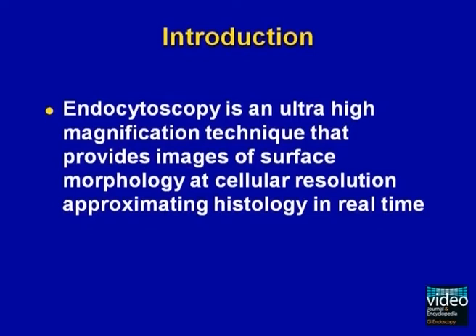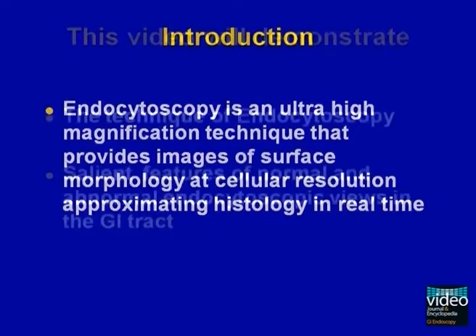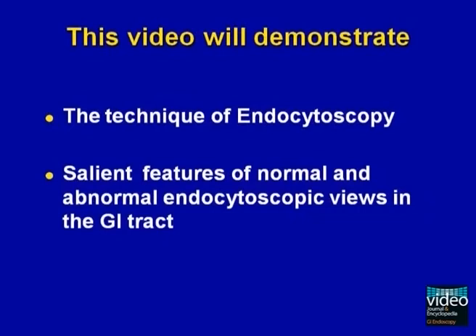Endocytoscopy is an ultra-high magnification technique that provides images of surface morphology at cellular resolution, approximating histology in real time. This video will demonstrate the technique of endocytoscopy and the salient features of normal and abnormal endocytoscopic views in the gastrointestinal (GI) tract.